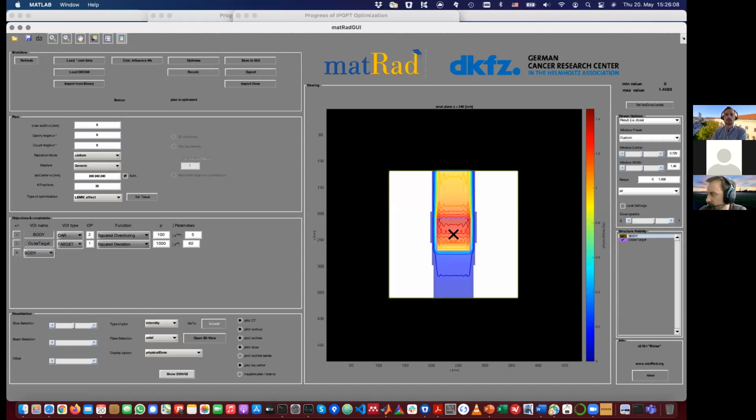But what you were pointing out before is also a really crucial point. From a treatment planning perspective, we can do fancy things and basically assign an alpha beta ratio to each voxel individually. But the question is, how do you really get these values? How do you get radiosensitivity parameters upfront to the treatment? This is really a not so trivial task, and therefore people took a very conservative approach, and we also know from clinical trials that the current assumptions do work. All right.